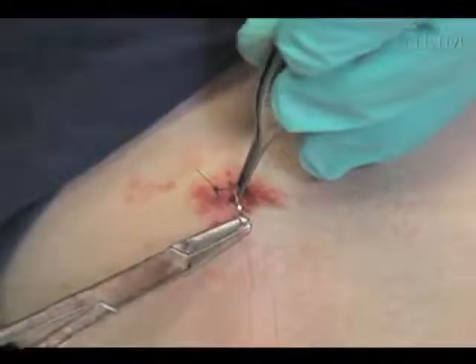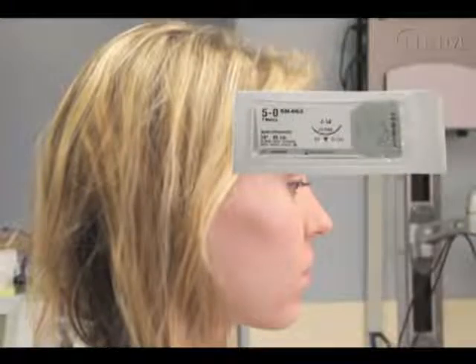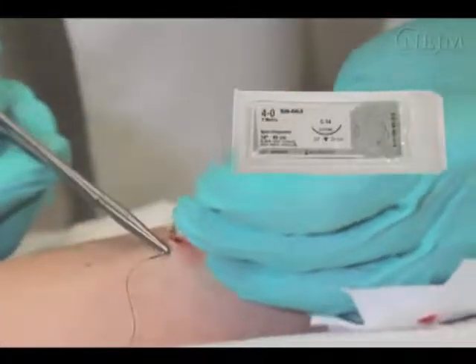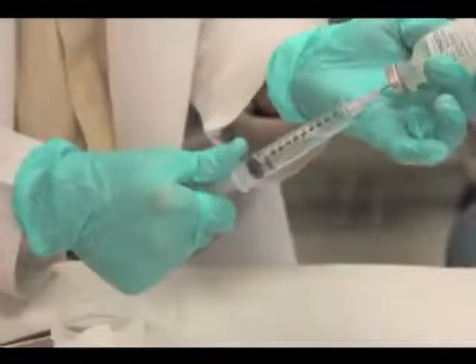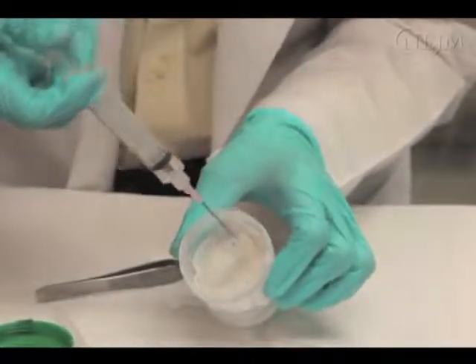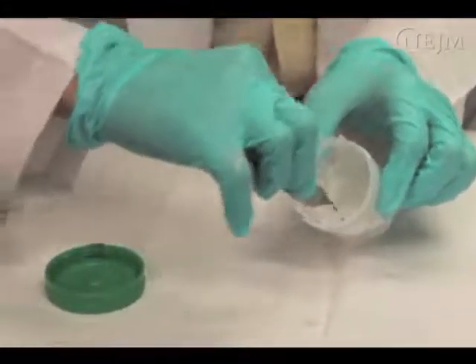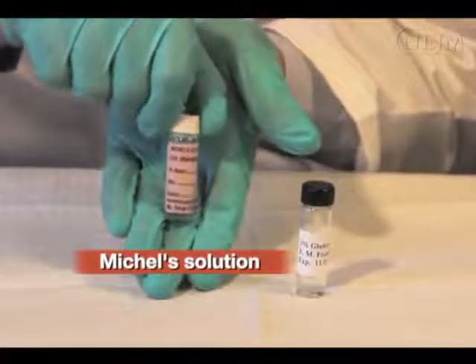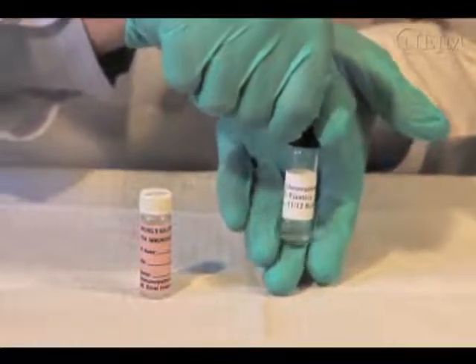For larger biopsies, the wound should be closed with a non-absorbable suture such as nylon or polypropylene. In general, for thick skin such as the back or volar skin, a 3-0 reverse cutting suture is advised; a 5-0 suture is recommended for the face, and a 4-0 suture for the rest of the body. The vast majority of skin biopsies are transported in formalin for routine hematoxylin and eosin stain. If a tissue culture is needed, sterile technique should be used and the specimen placed on a 2-by-2-inch piece of sterile gauze pre-moistened with 10 cc's of non-bacteriostatic saline inside a sterile cup. For immunofluorescence studies, Michel's solution containing ammonium sulfate is used; glutaraldehyde is used as transport medium for electron microscopy.